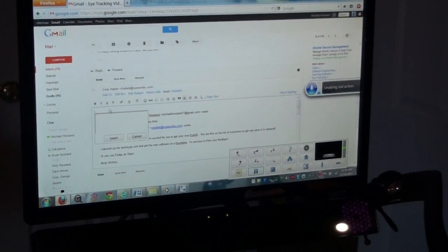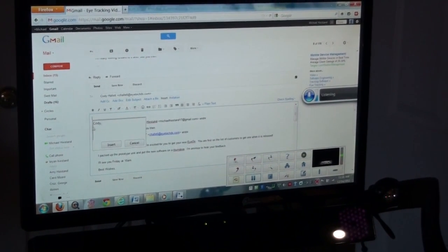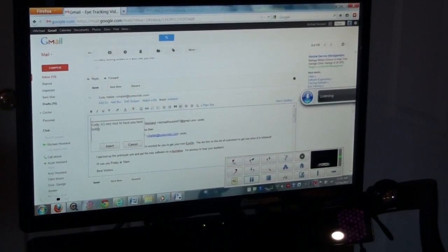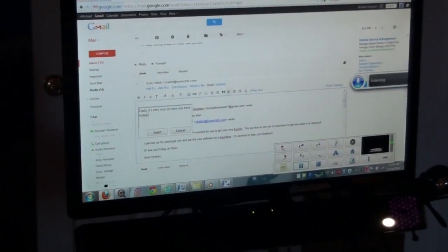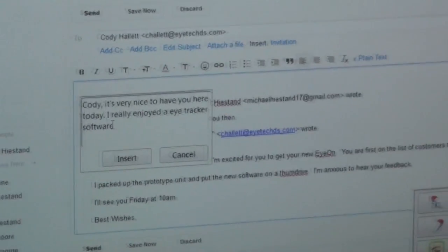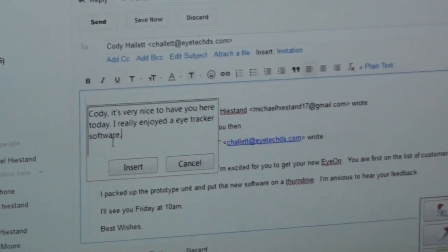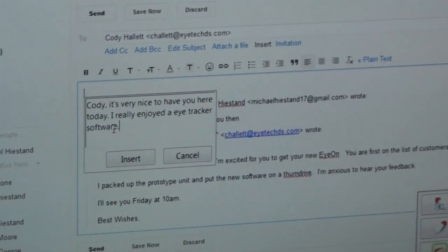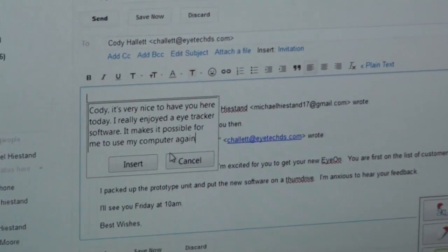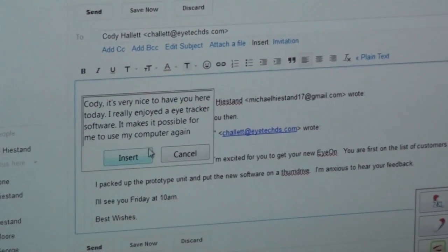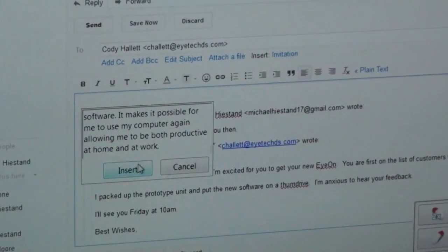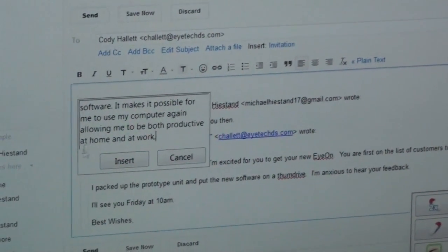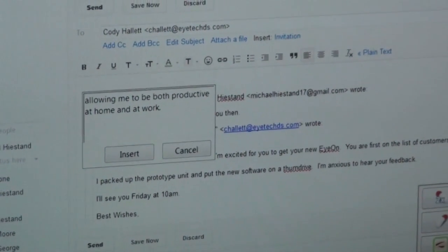Cody, comma. It's very nice to have you here today. Period. I really enjoy the eye tracker software. Period. It makes it possible for me to use my computer again. Allowing me to be both productive at home and at work. Period. New paragraph. Mike. Michael.